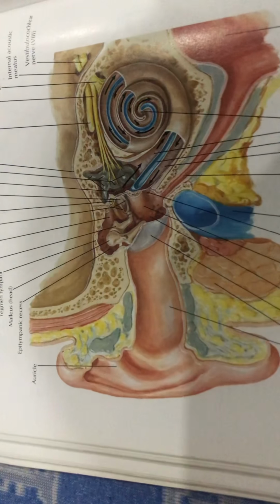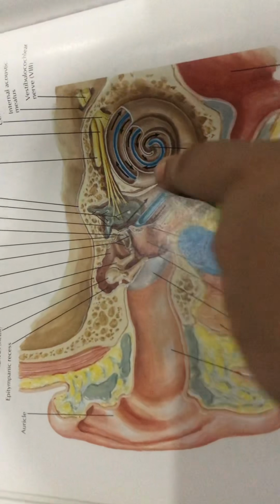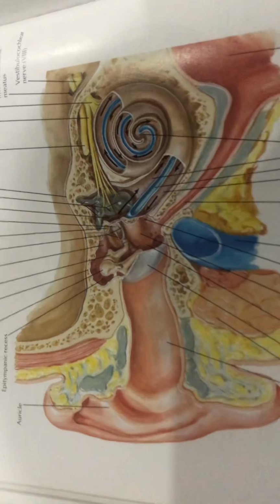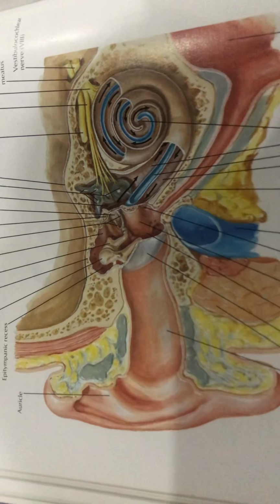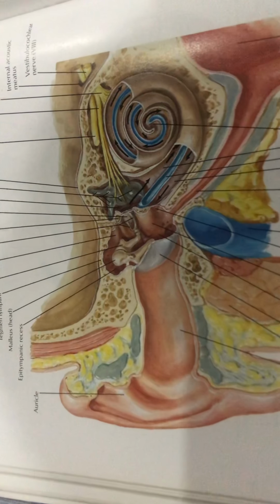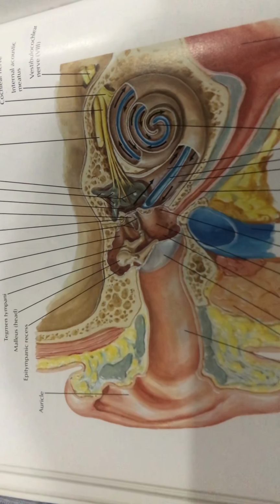Whereas the bone conduction bypasses this air conduction and directly stimulates the cochlea or the auditory nerve. The cochlea and the auditory nerve are normal in case of a conductive deafness. Thus the bone conduction is normal, and normal hearing is below 25 decibels. So the bone conduction graph gets plotted below 25 decibels.